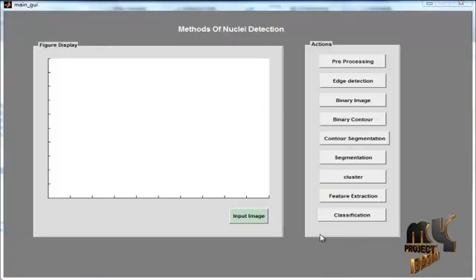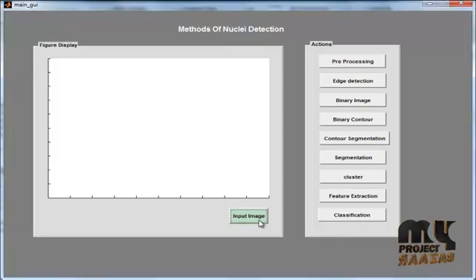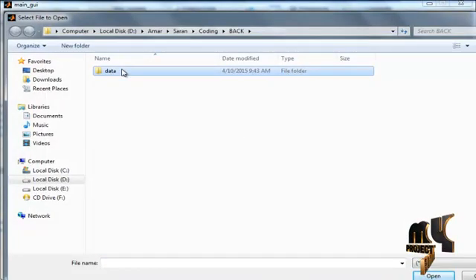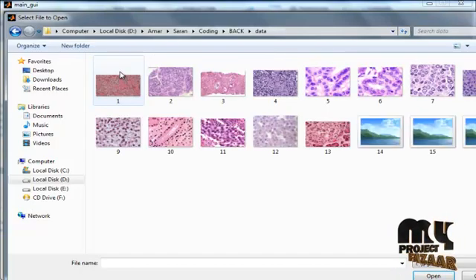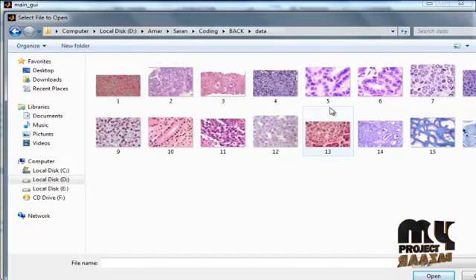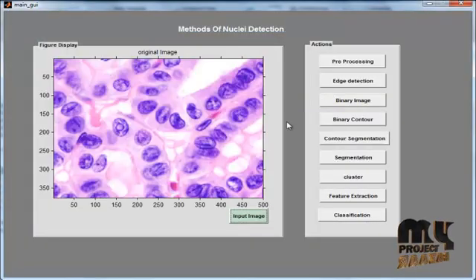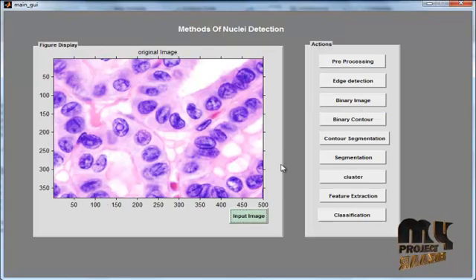Now we discuss the processing. This is the input button. If you click the input image button, the data folder will open. By double-clicking the data folder, we can see the dataset images in that folder. Select any one image from the dataset — the title will show as the original image, and the image will be plotted in the axes.